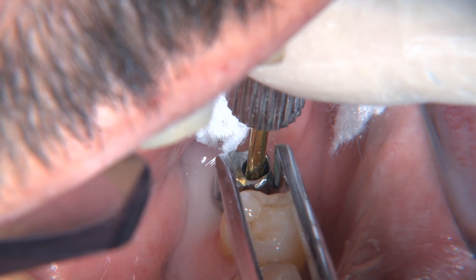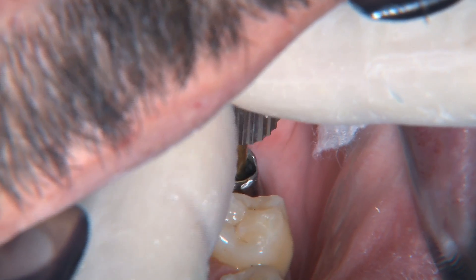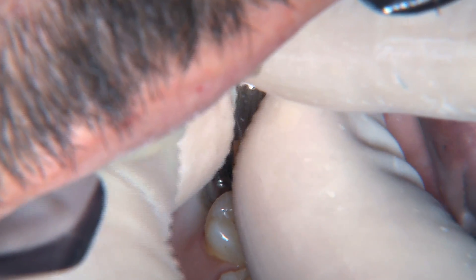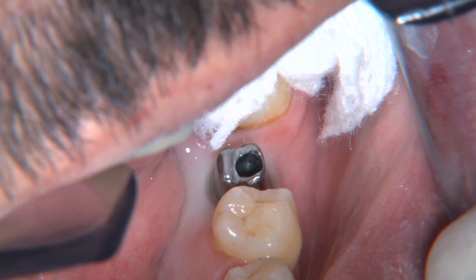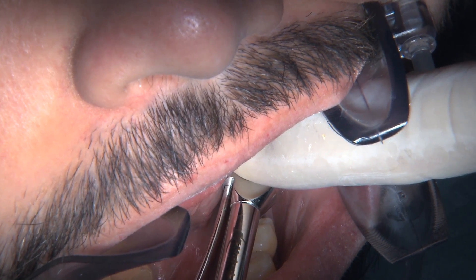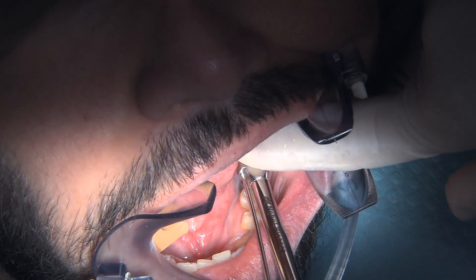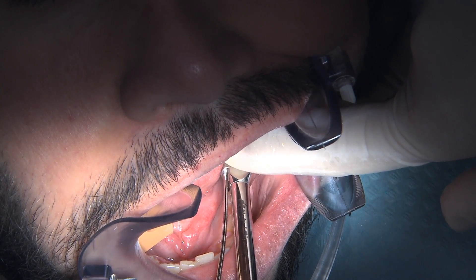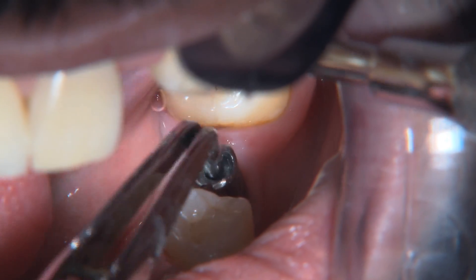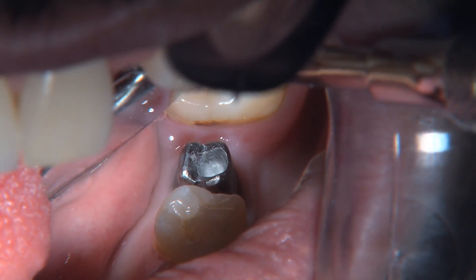The implant abutment is held by my assistant while I start the screw by hand a couple turns, then put it in the rest of the way with the torque wrench. You can see the flat surface on the implant abutment facing the buccal — it just sucks down into place as we make the next turns with the torque wrench. Once the abutment is torqued down fully on the implant, we place a small cotton pellet on the head of the screw to keep it nice and clean.